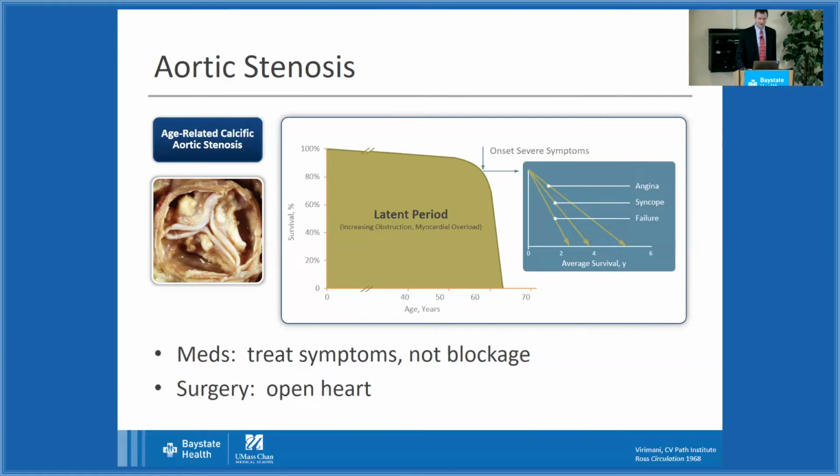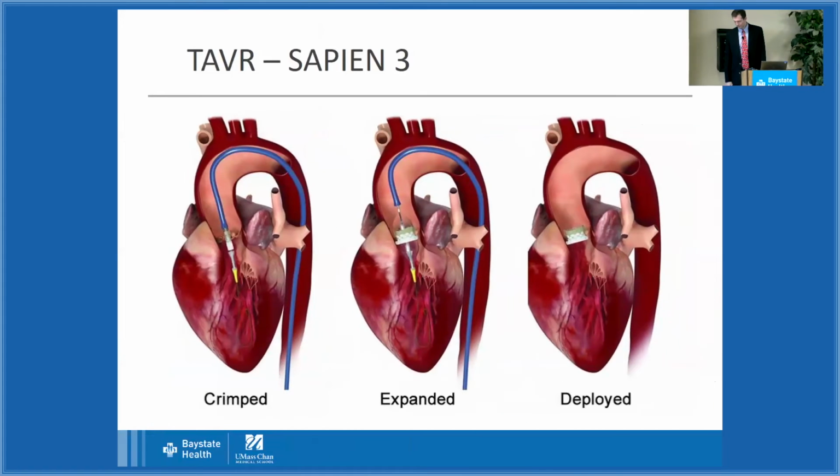So, transcatheter aortic valve replacement. Usually the acronym is pronounced TAVR. And I'm going to show you two devices. This is the SAPIEN valve. And it's delivered on this catheter, which made it to the bottom of the pile. So the catheter is identical in size to the catheter we use for left atrial appendage occlusion.